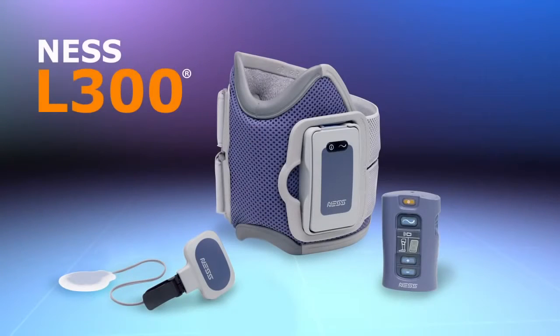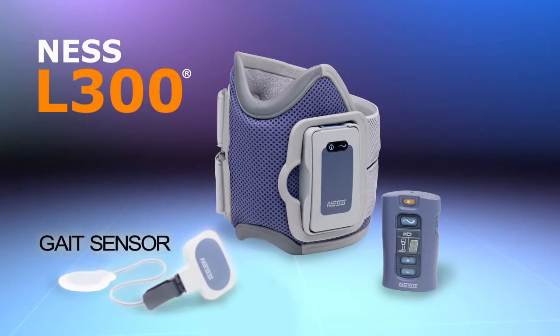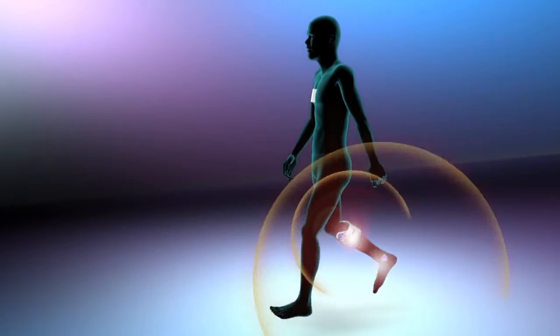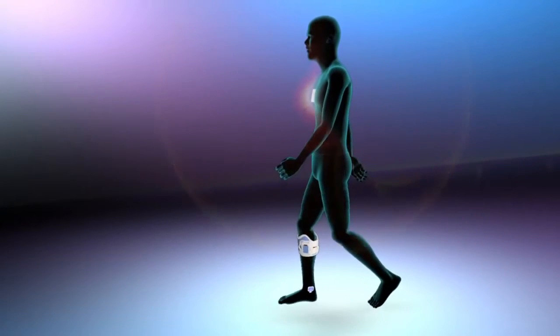The Ness L300 foot drop system consists of three main components: a lightweight cuff that fits below the knee, a small gait sensor placed in the shoe, and a wireless control unit, all of which communicate wirelessly, eliminating the need for troublesome externally worn wires and connectors, making the system simple and easy to use.